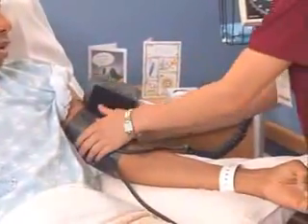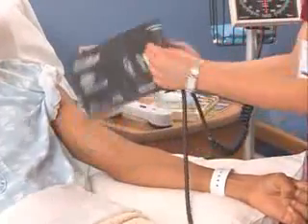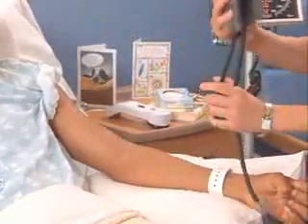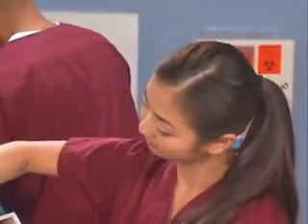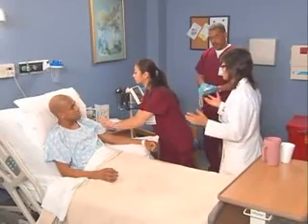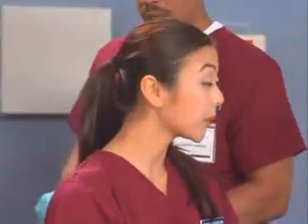We only get one of the measurements with this method. I see. Thanks. As Rose said, this method only provides a systolic pressure reading, but it would at least give us some information about the patient's situation. If it were actually measuring the patient's pressure this way, we would need to identify the arm used and the site of the assessment if it was done other than on the brachial. And I'd let the appropriate person know if there were any abnormal findings.